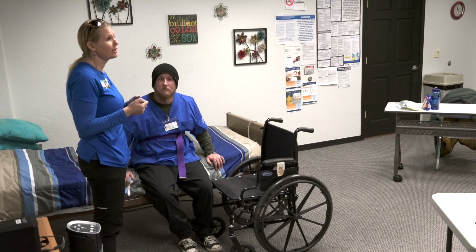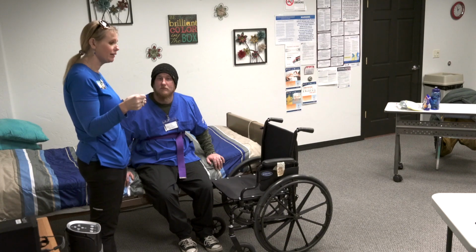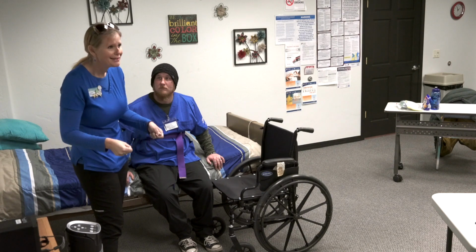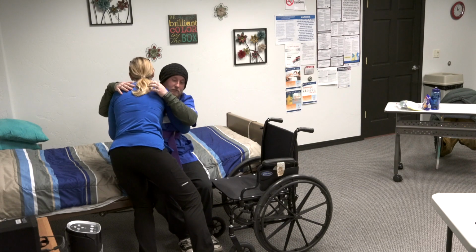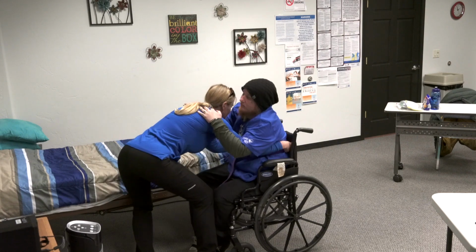This is going to be like a bear hug. So I'll be grabbing onto the gait belt with this arm and this arm, but it's going to be more of a pulling over, not a lifting up. Cody, if you'll just put your hands up here, and then on the count of 3, we are going to go sit in that chair, okay? 1, 2, 3. Very good.